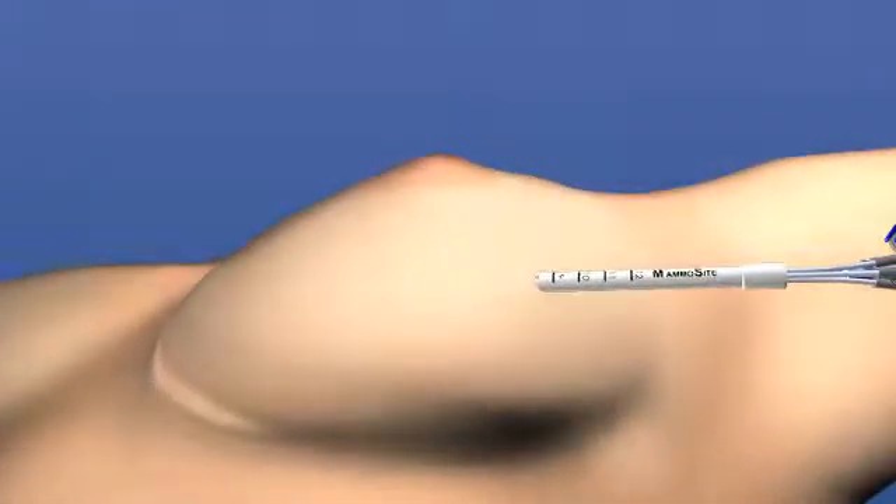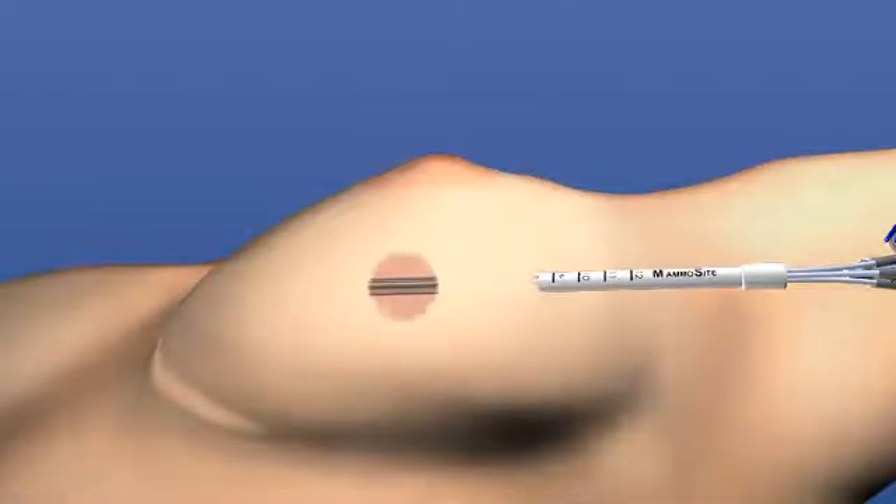the mammocyte catheter is attached to a machine that houses the radiation source. A thin wire with a tiny radioactive seed on the end moves up the catheter under precise computer control into the balloon.